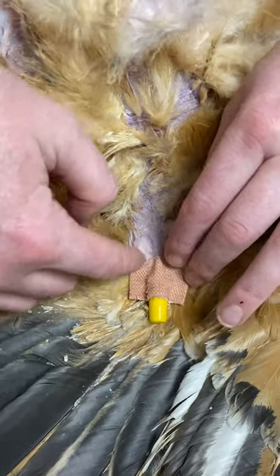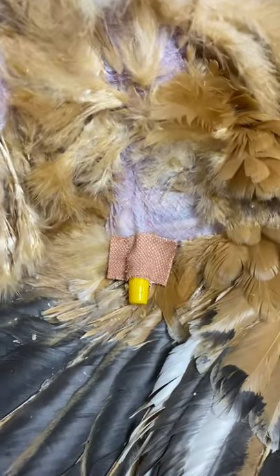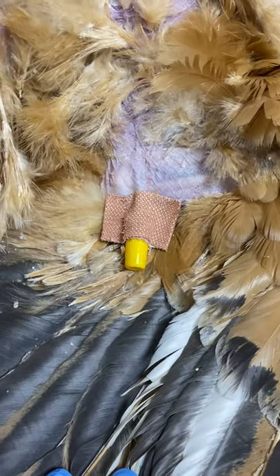These catheters can stay in here for a couple of days, and it means that you've got intravenous access for your fluids but also your medications.